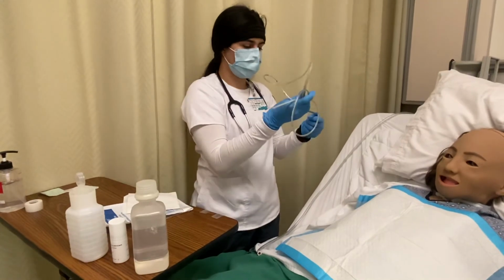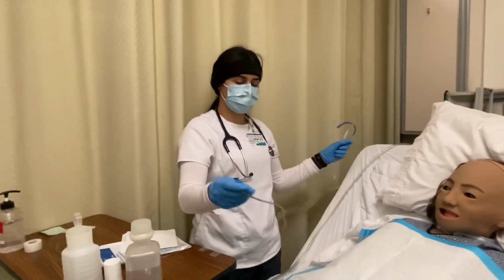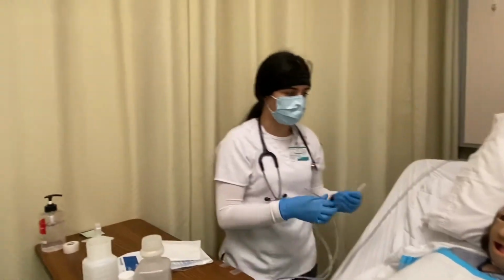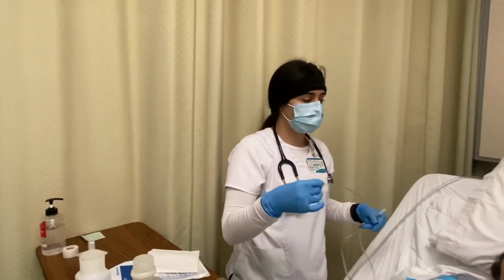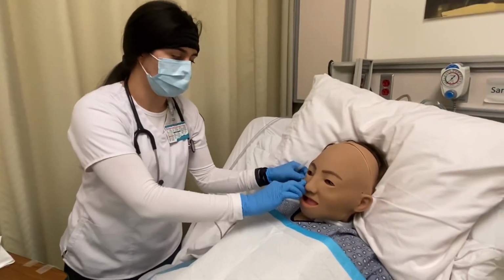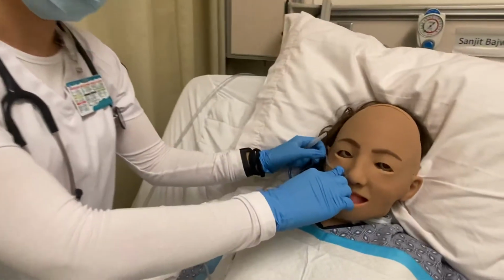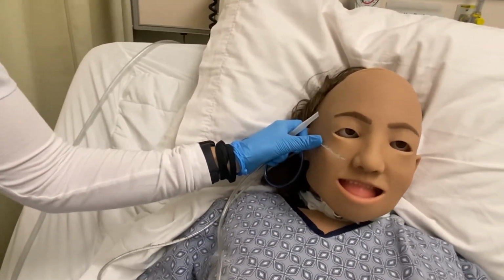So what I'm going to do right now is measure. I'm going to measure from the nose to the ear to the xiphoid process.